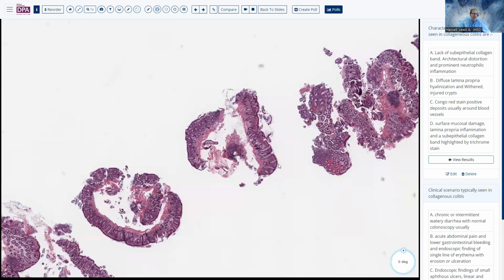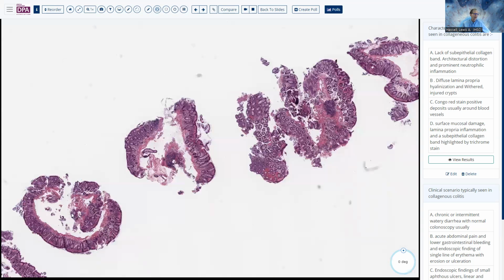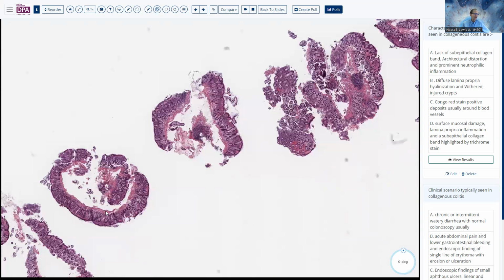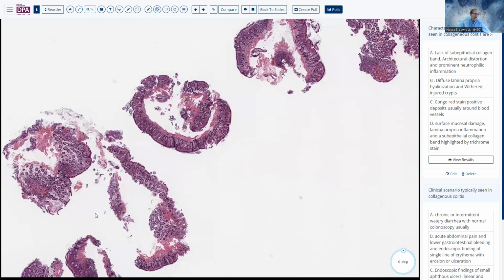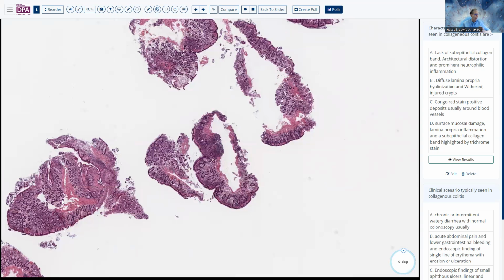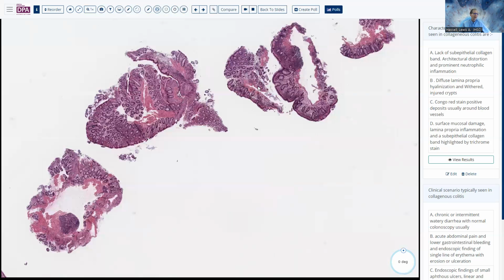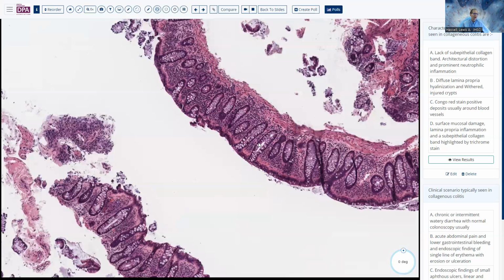So let's go back down to low magnification and see where the clues are. Well, here's an extra clue, sort of pink along the subepithelial membrane, also here. So we're seeing a little bit of increased pink tissue. And also, these are all quite uniformly blue. The colon is diverse in terms of its normal distribution of inflammatory cells, having more inflammatory cells on the right colon and progressively fewer as you progress to the rectum. So seeing a sample where they're pretty much all bluish should make you think that there may be some inflammation going on.